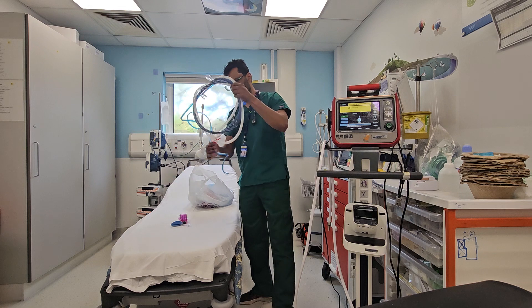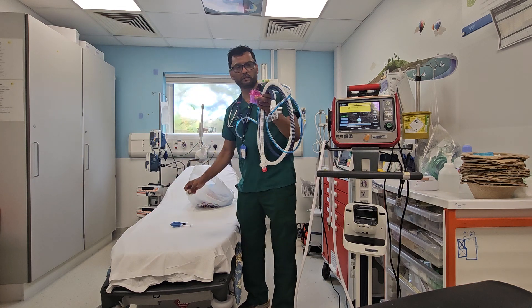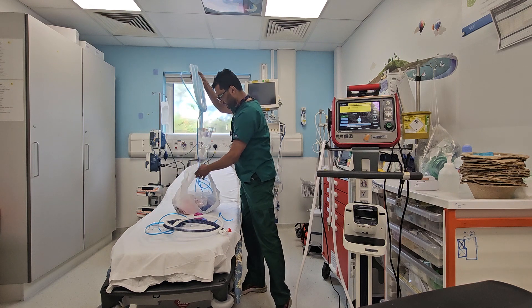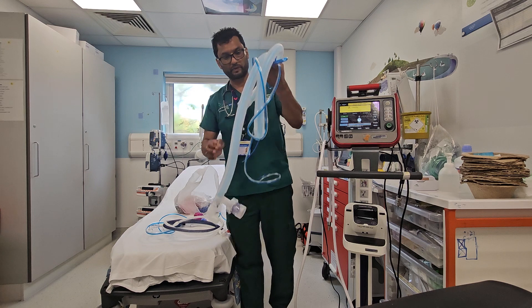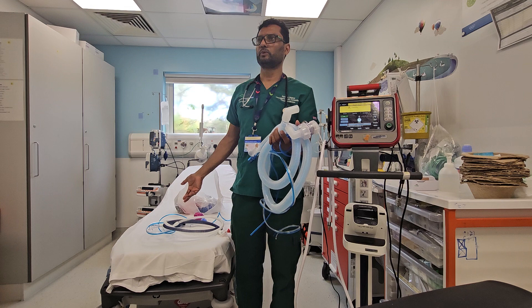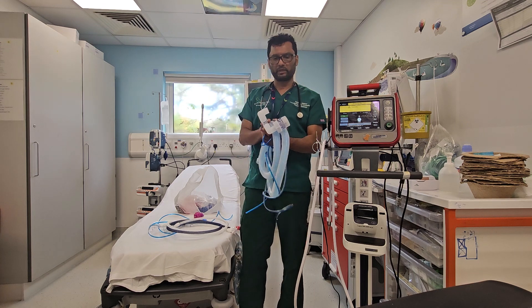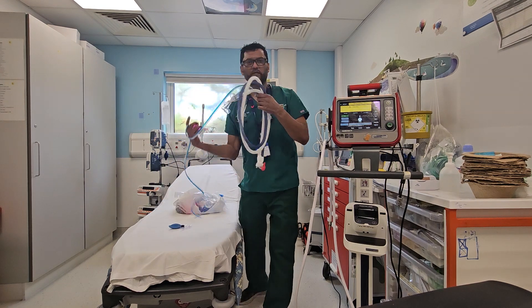This is a neonatal circuit which comes with a pink attachment, so that's for up to 10 kilos. Then you have another circuit, the bigger circuit, which is also used for CPAP. There is a separate circuit for Optiflow. But just remember: bigger child over 10 kilos uses the larger circuit, and smaller child up to 10 kilos uses the neonatal circuit.